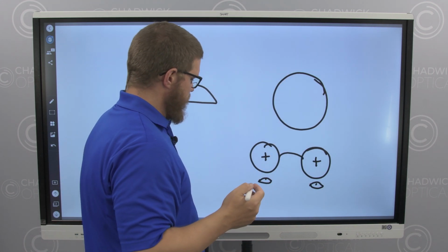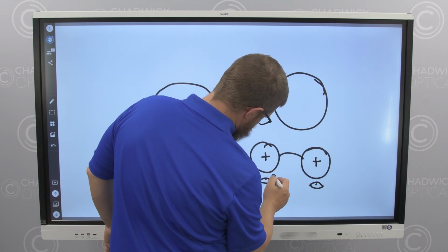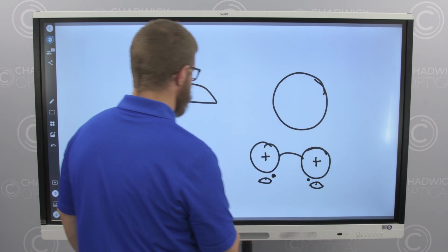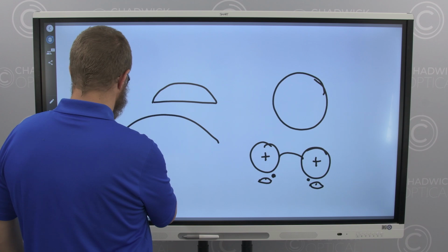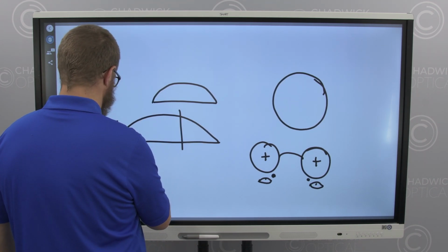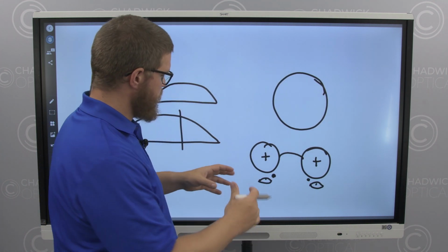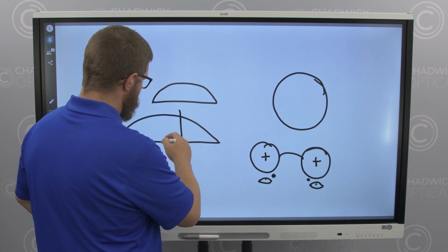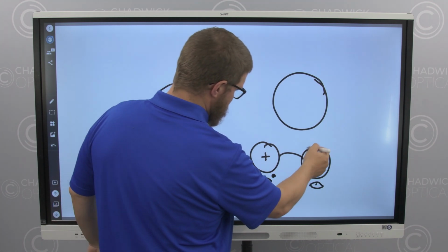Now if you don't do that, say that the patient's eyes are in here, what we need to do is make the lens thicker and then cut it here and here. So what's going to happen is if you force a patient with a narrow PD into too large of a frame, we need to move the center in. What that requires is a thicker lens, and it's going to be very thick in the nasal of the frame.